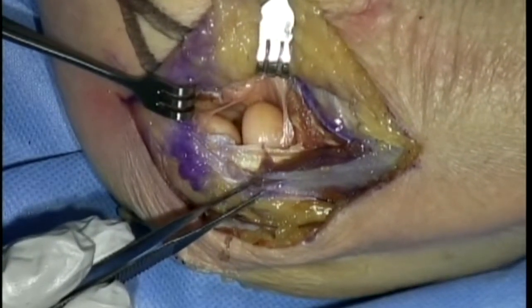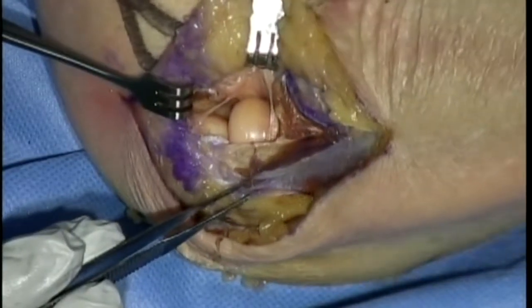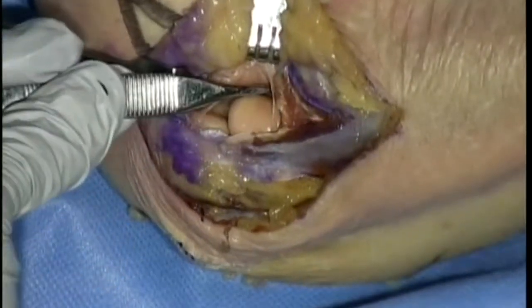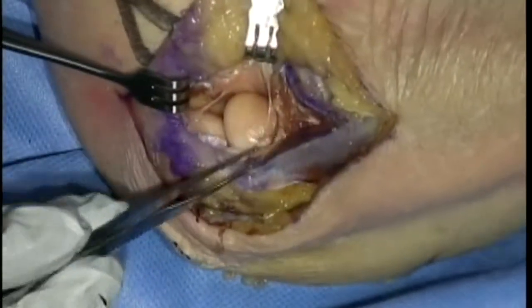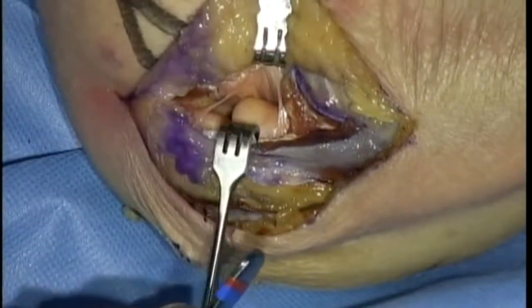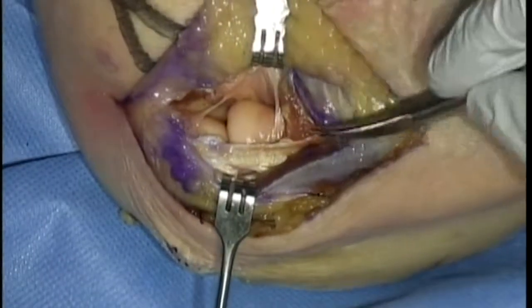So what we do there is, if you pronate and supinate the forearm, you want to put the plate directly lateral when the arm is in that neutral rotation position, so that when you're pronating and then supinating, it doesn't hit up against the ulna. What you do see with this exposure quite nicely is the lateral collateral ligament, which we're pointing out right here.